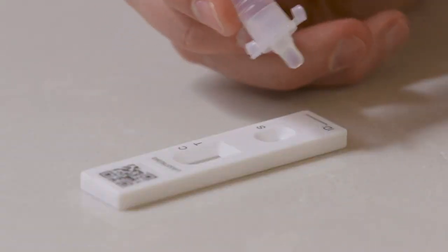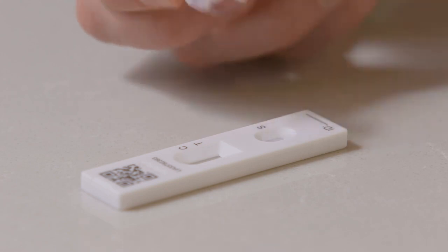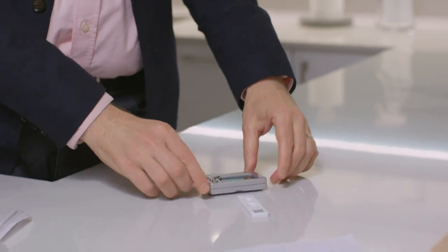Squeeze the extraction tube to place two drops of fluid on the test strip. Watch out for any air bubbles. Set a timer for 30 minutes and leave the test strip on a clean flat surface.